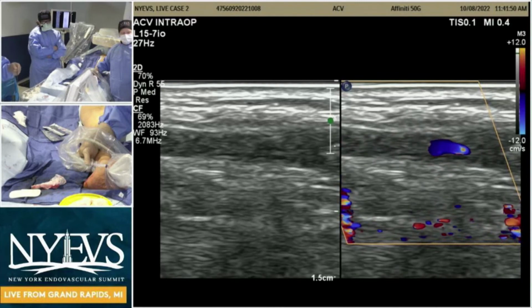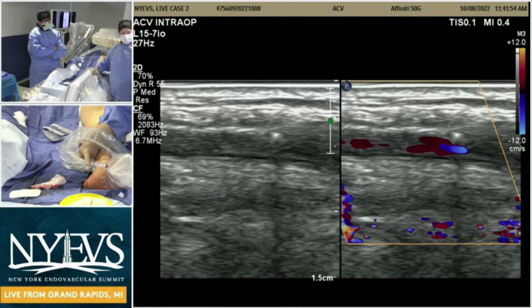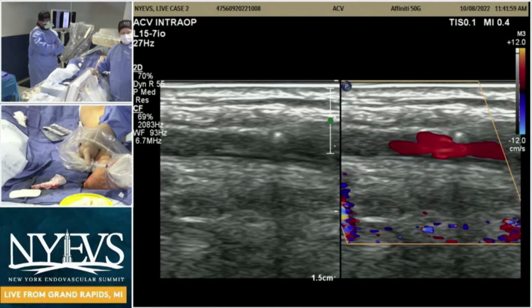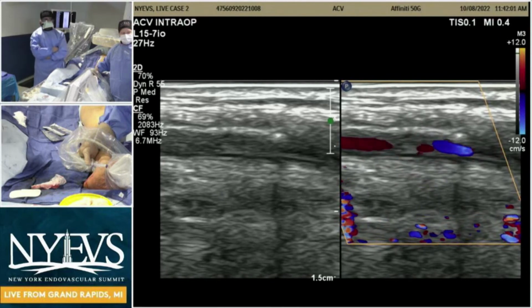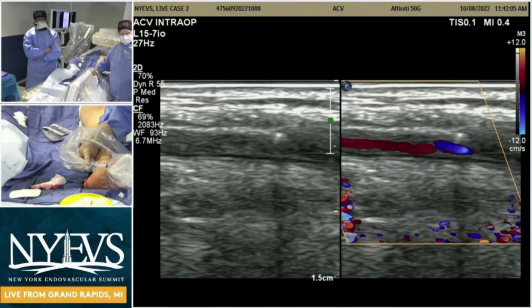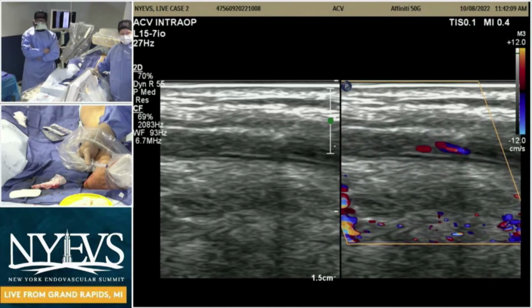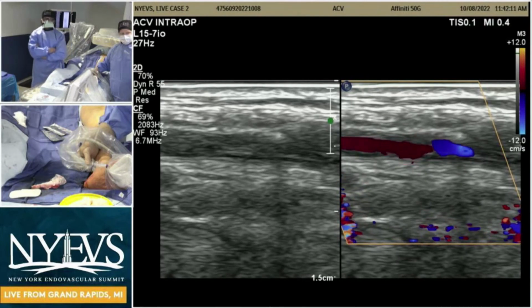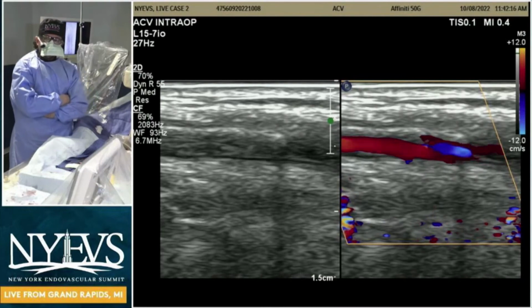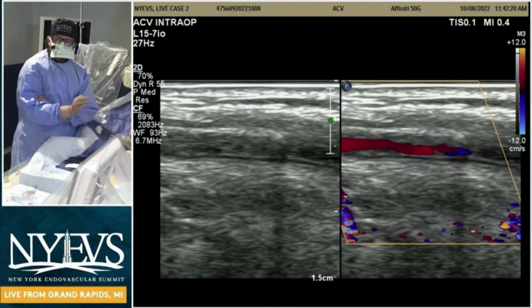Yes, so while we have Fadi here, I just want to pick your brain for two seconds, since you're a pioneer in this field. Tell me about your technique for peroneal access and hemostasis. So a question on peroneal access and hemostasis, Fadi. You know what? If we get hemostasis and I still have time, we'll show you how we do that with ultrasound guidance.